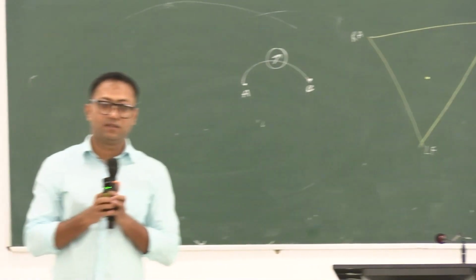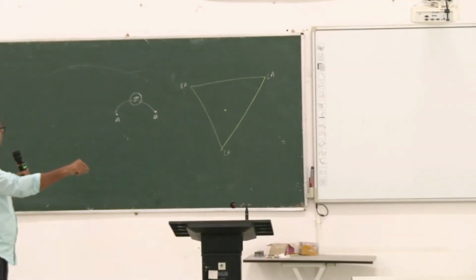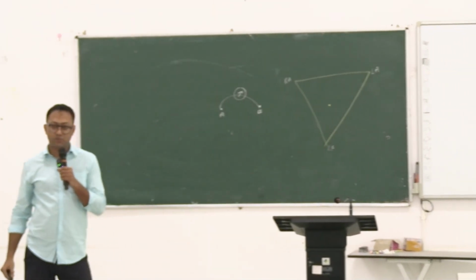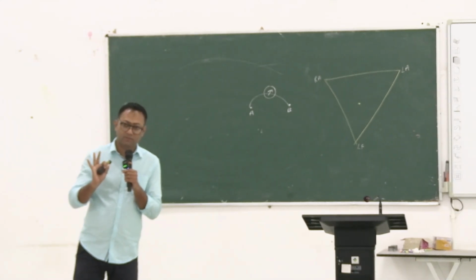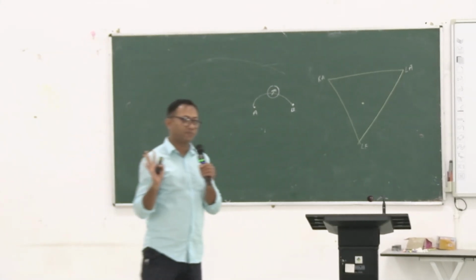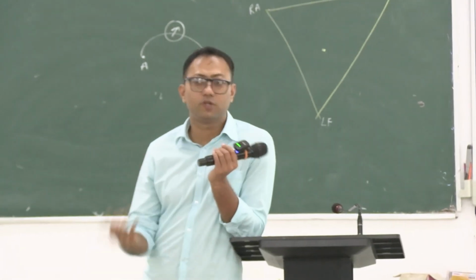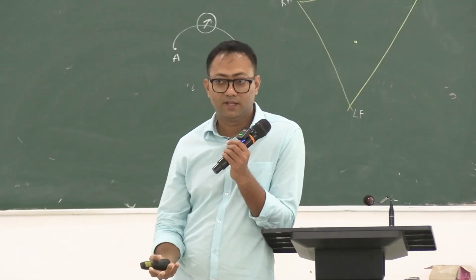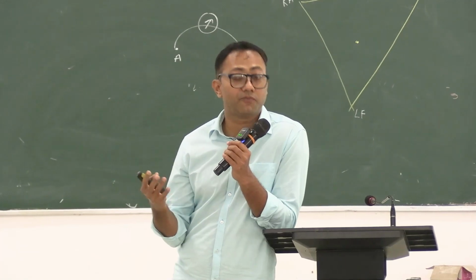So lead 1 is this, RA to LA, the potential difference between RA and LA. Lead 1 measures the potential difference between RA and LA. So where did we start from? We have got some copper wires and we have got some voltmeters, right? We will construct lead 1 of an ECG machine.